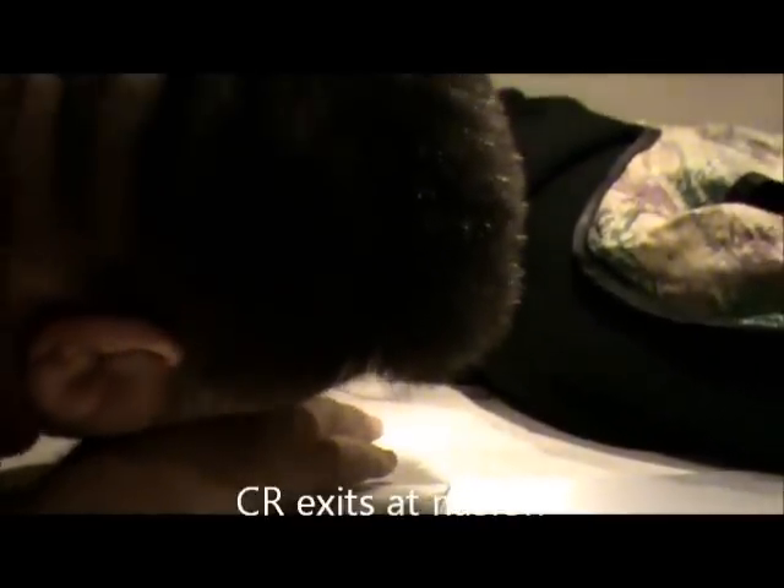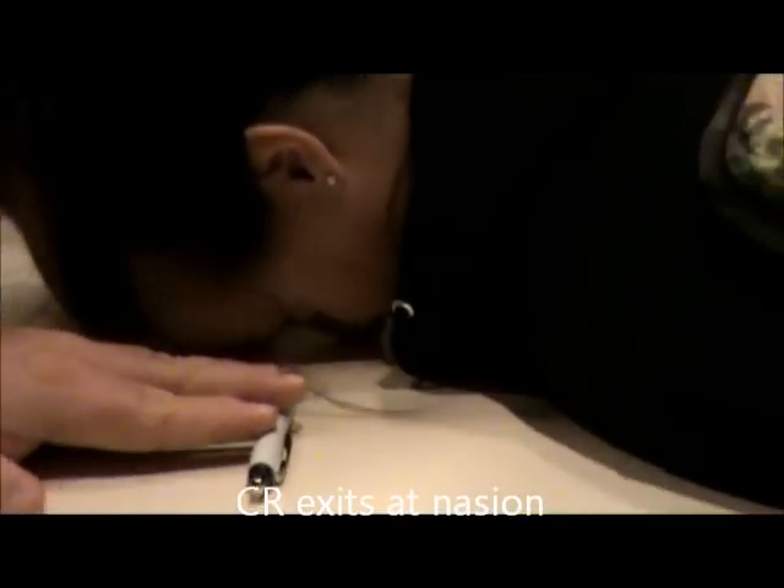I'm going to make sure I use the full body shield again for head work. My centering for this is going to exit at the Nasion. I'm going to use my pen and mark right at the Nasion. Then I'm going to center at the MSP. I'll open up my collimation so I can see it on my pen, and I'm centered at the MSP.